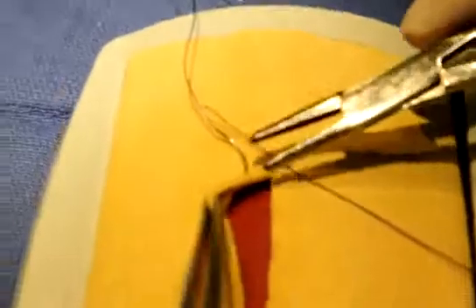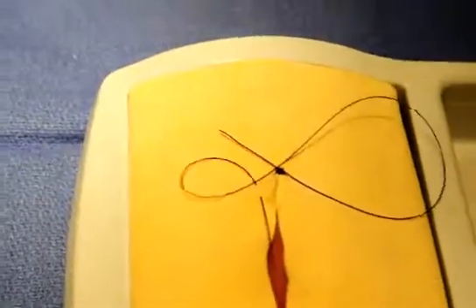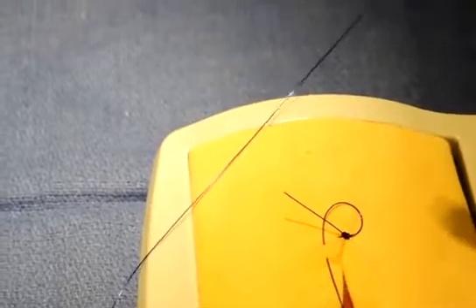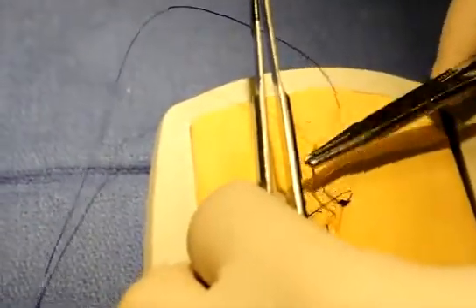Okay, and if we look on the inside, see, whoop, so I didn't do it right. Try again here. This is very thin material. There we are. So the needle did not penetrate into the inside. Now that's what a Cushing would do. The needle bites do not penetrate to the mucosa, and they run parallel to the incision. Get that tag end out of there.